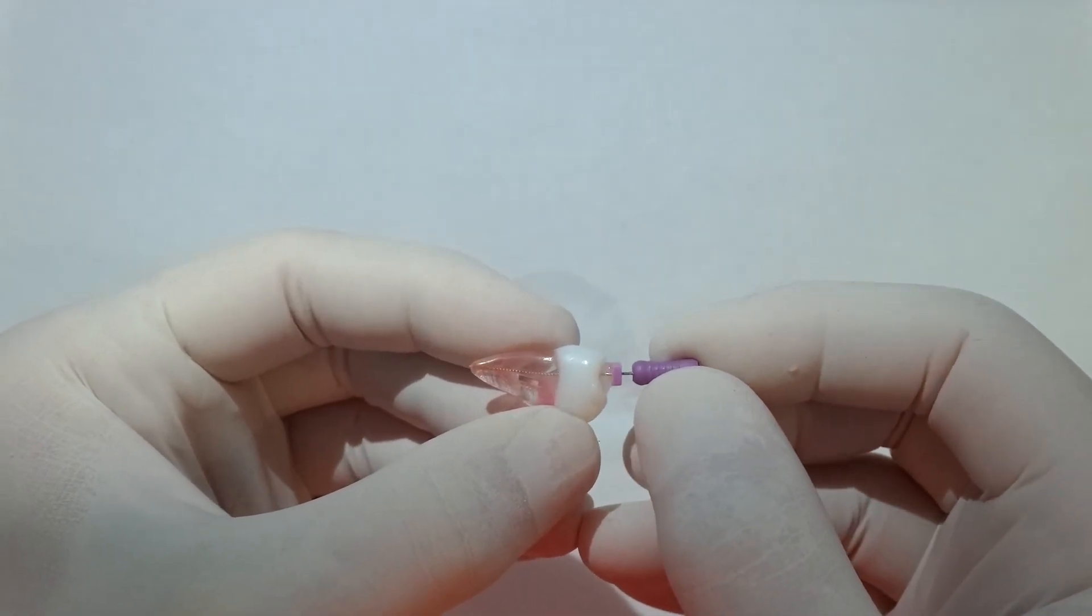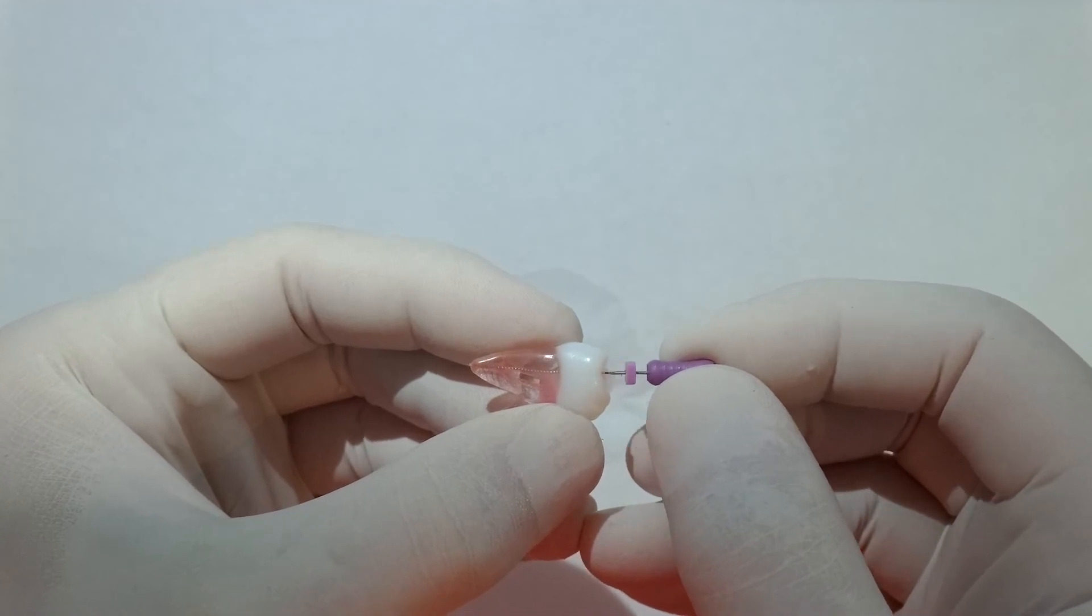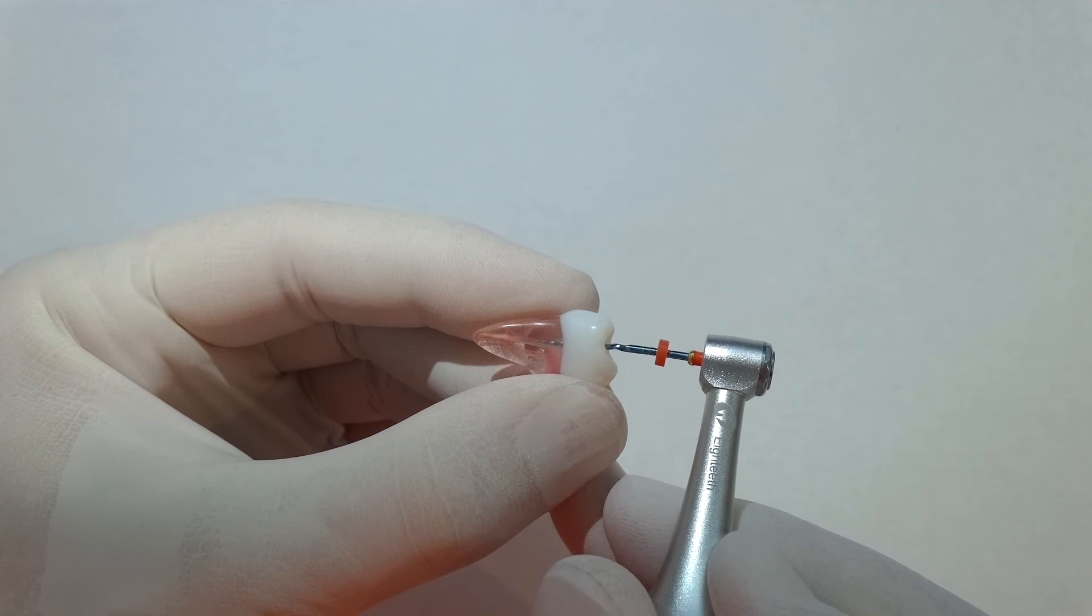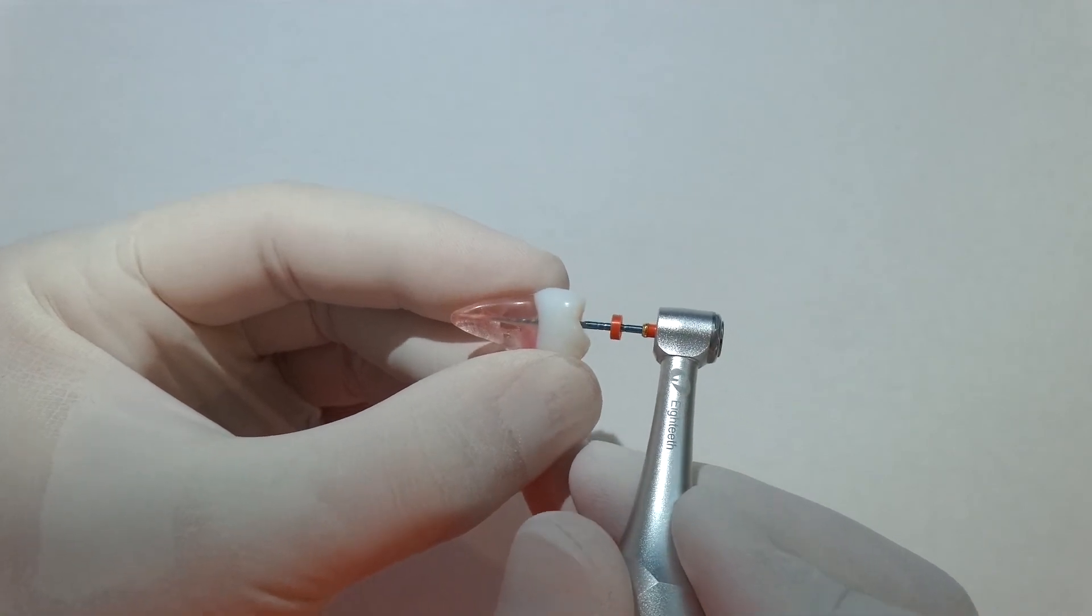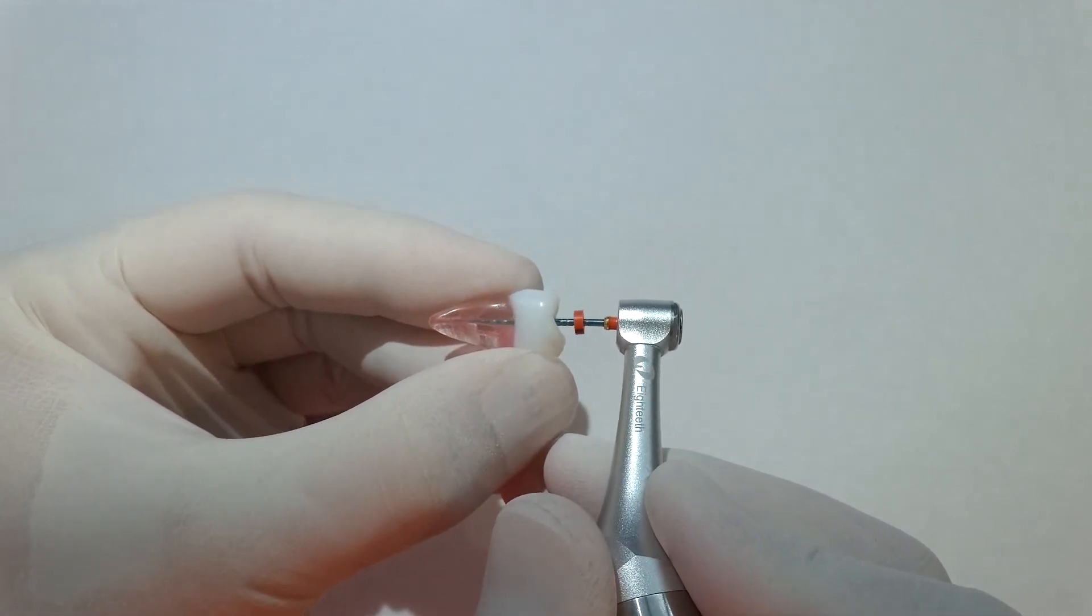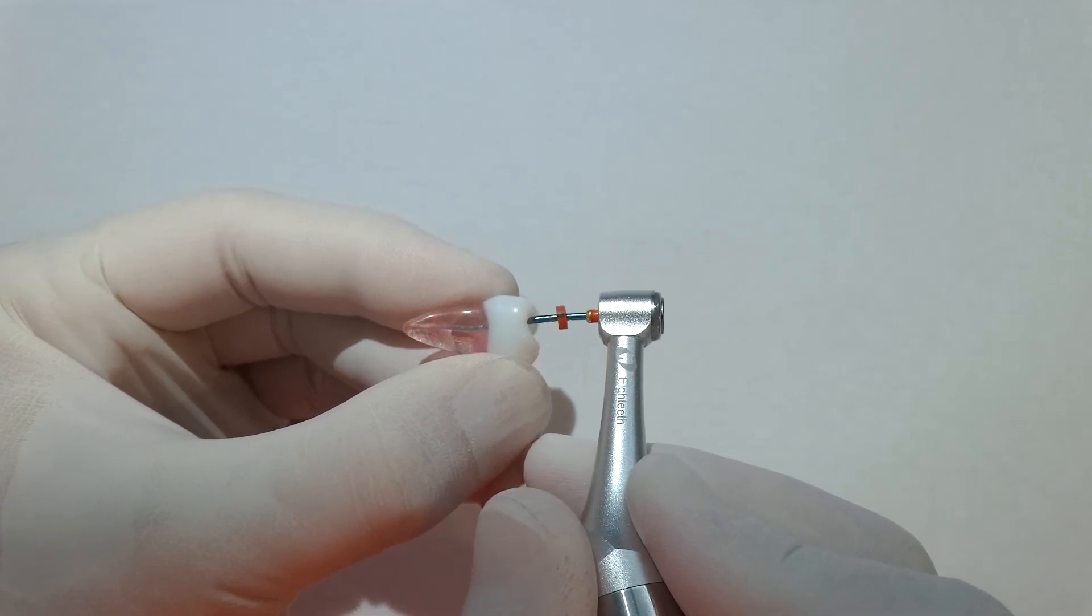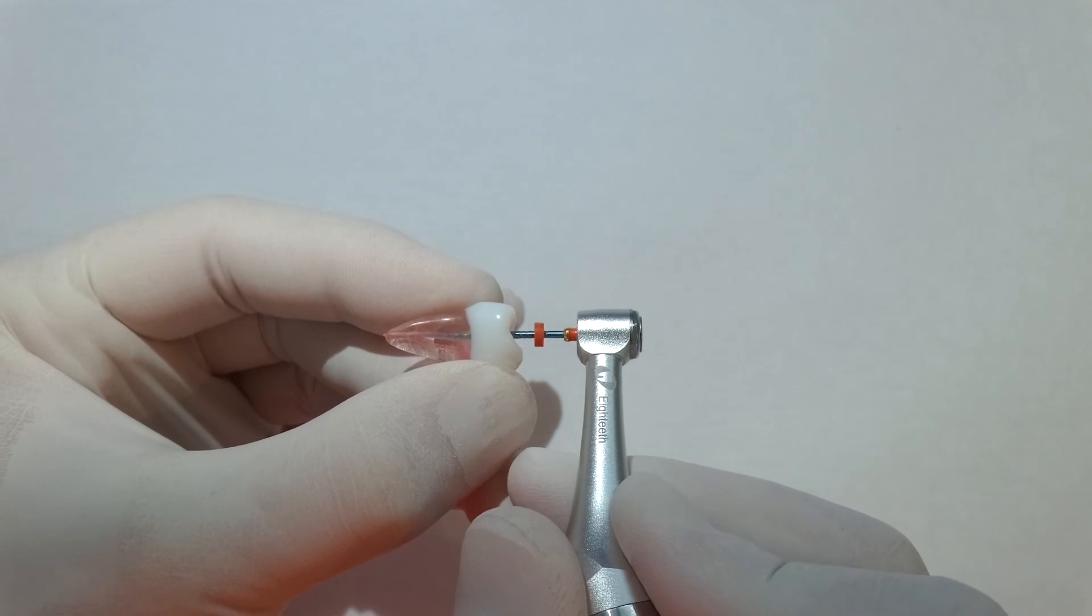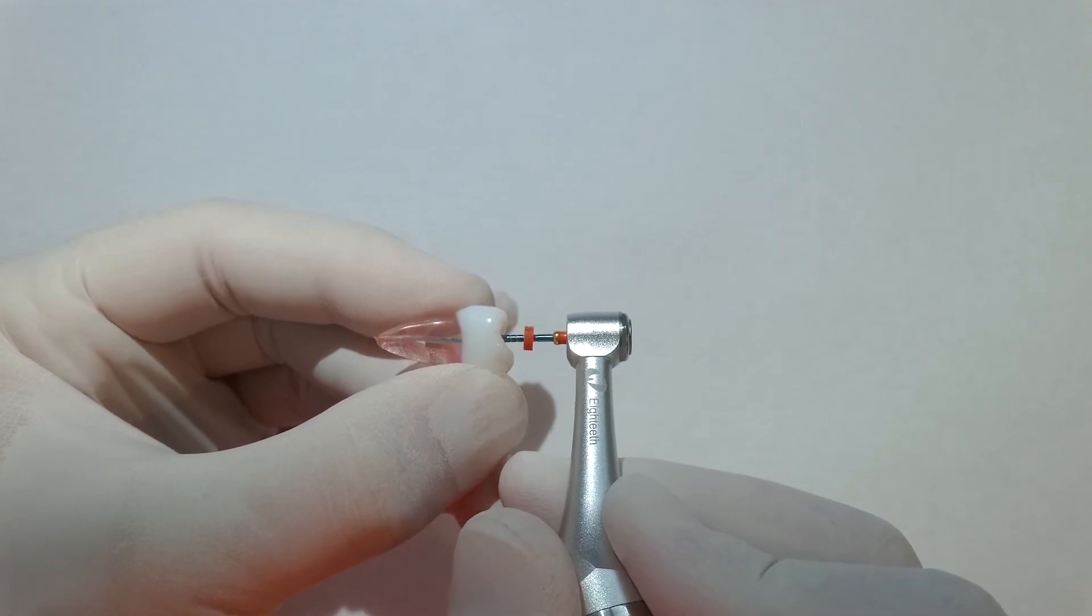This is an F2, this is a 2508, just to give us a little bit more shape apically. Exactly the same principle. We've gradually progressed the file, just gradual pecks until it reaches the full working length. Again, the same principle: as soon as that's got to length, its work's done.